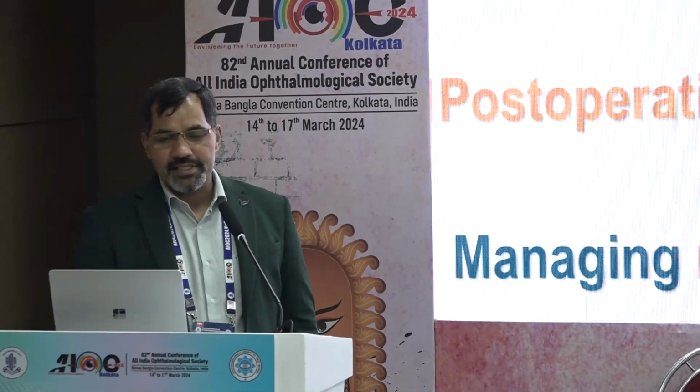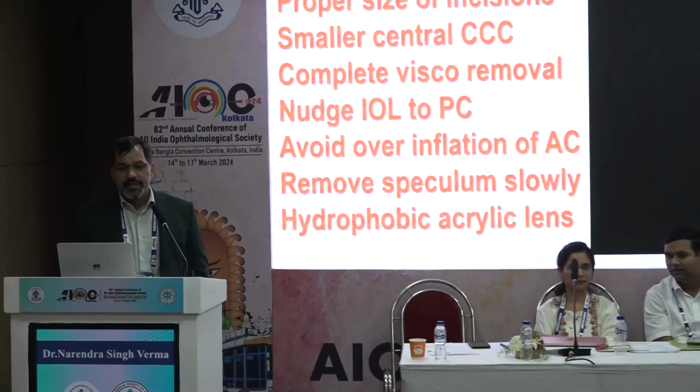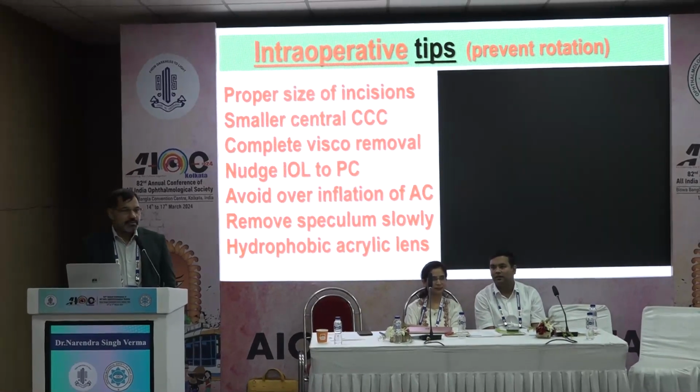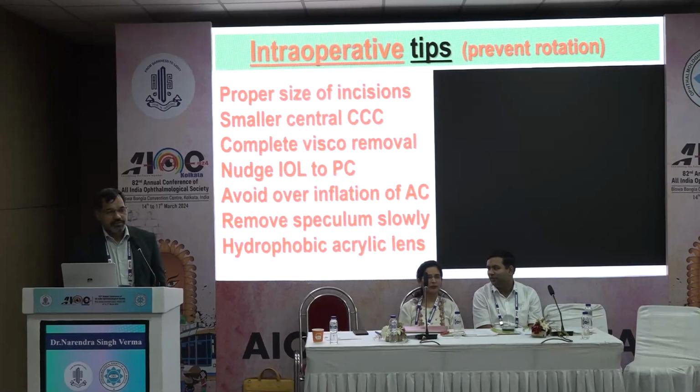So now, management of astigmatism, we will discuss the intraoperative tips and complications, post-operative monitoring, and managing of the residual error. So, these are some intraoperative tips which prevent rotation of toric lenses.